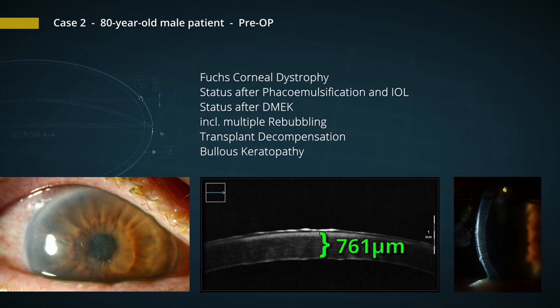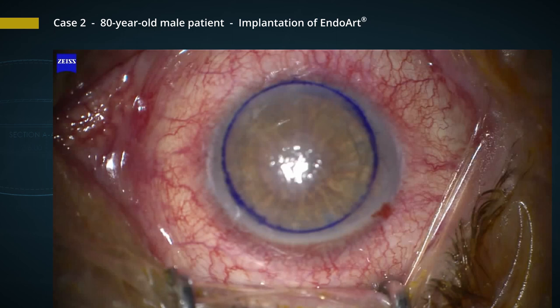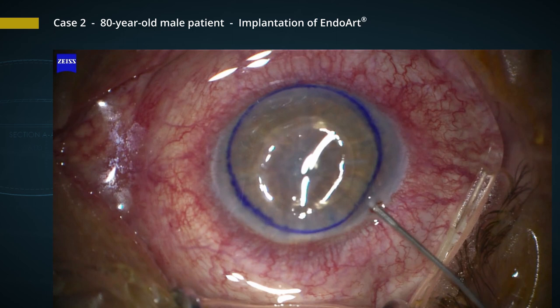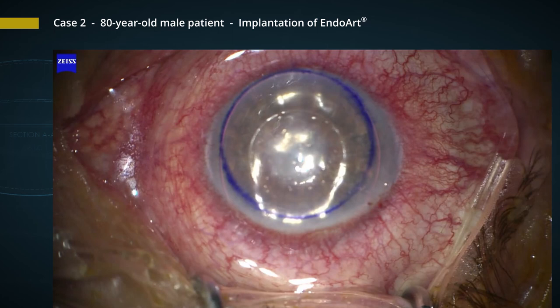Let's look at the second patient where we put this implant in. The second patient was an 80-year-old patient who had Fuchs corneal dystrophy. He suffered from bullous keratopathy, which also led to a very scarring epitheliopathy. Here you see the implantation: the lens was loaded into a conventional IOL inserter, then implanted through a 2.5 mm incision. We take a Sutter cannula to lift it up against the cornea, and fixate the implant with an air bubble.